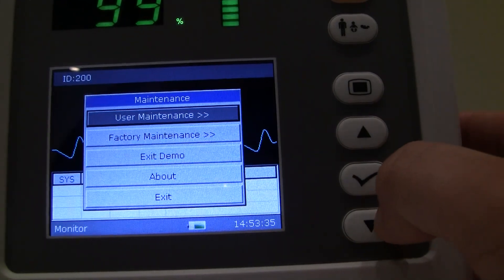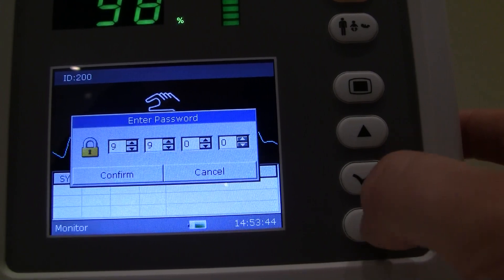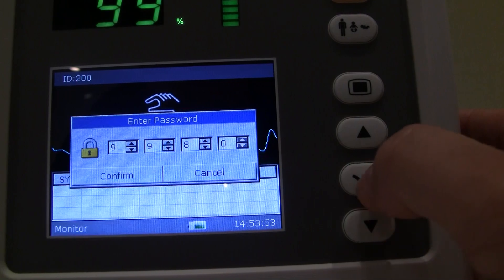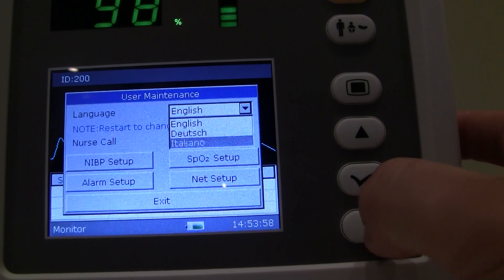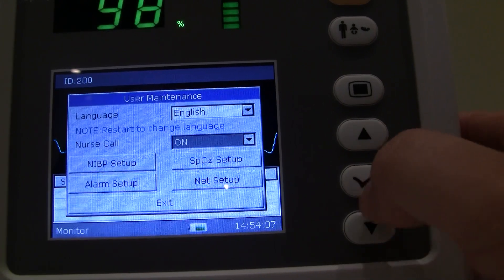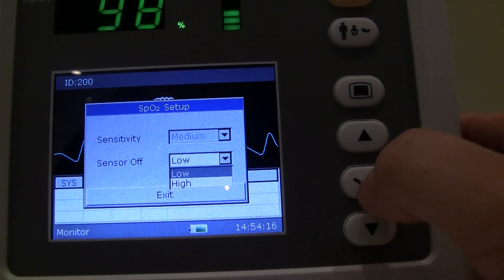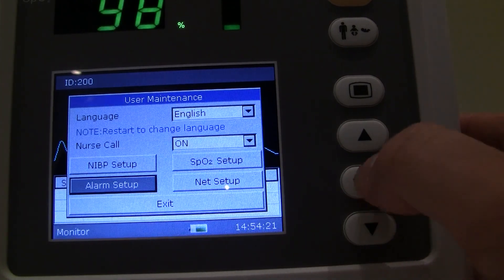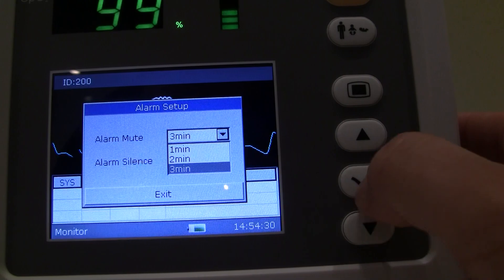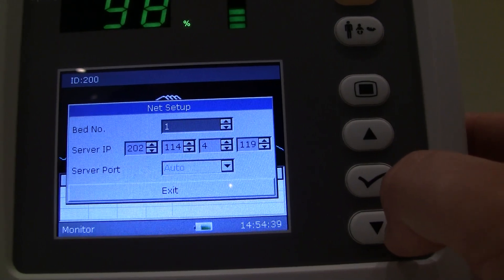System setup we already went through. Under Maintenance, the user maintain section requires a password located in your manual — it's 9981. Here you can select your language; it defaults to English but several languages are available. Nurse call can be turned on and off. NIBP setup lets you configure data capture. SPO2 setup allows you to change sensor sensitivity from low to high. Alarm setup lets you set alarm mute for one, two, or three minutes, with alarm silence currently on for demo purposes. This is also where you would go to network the unit if hardwiring it to a computer to transfer data.